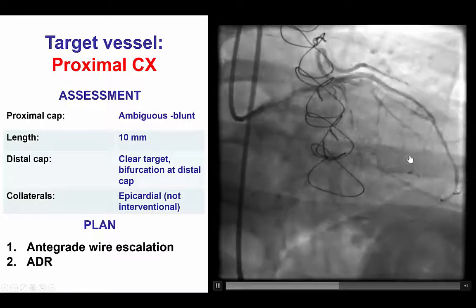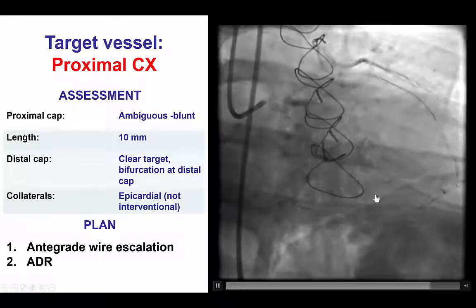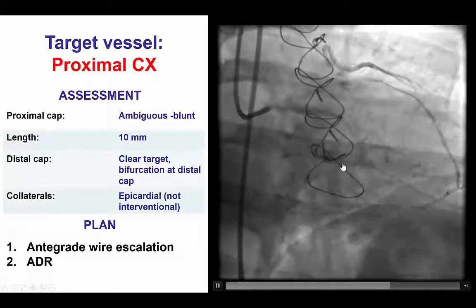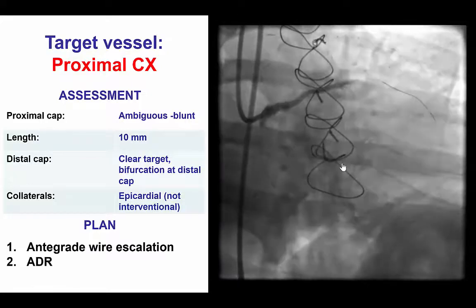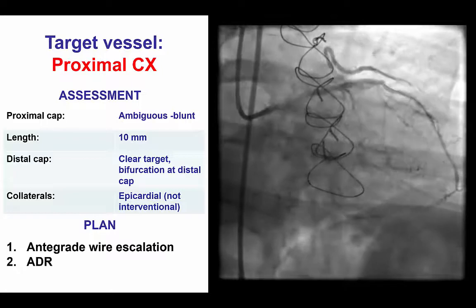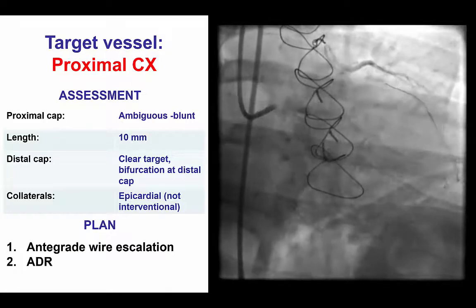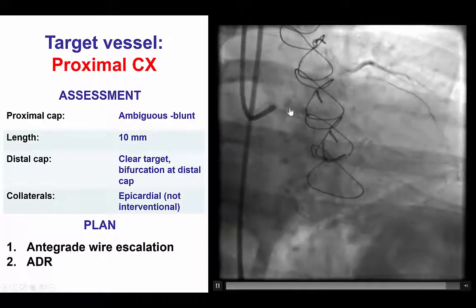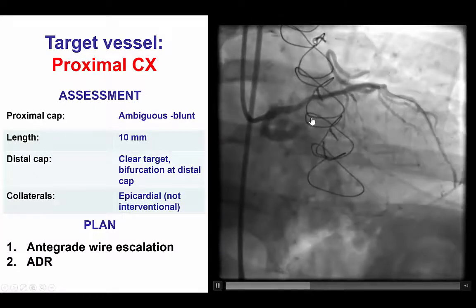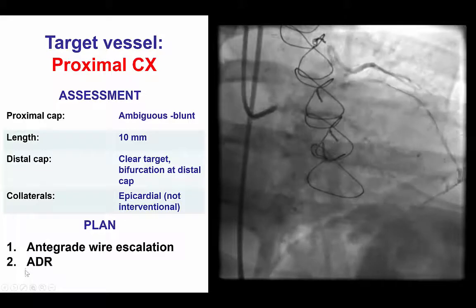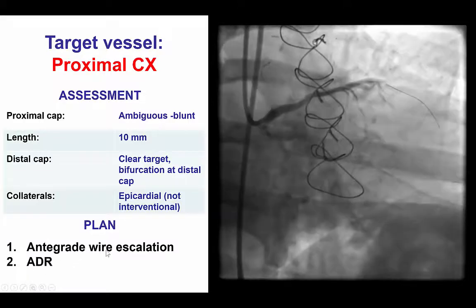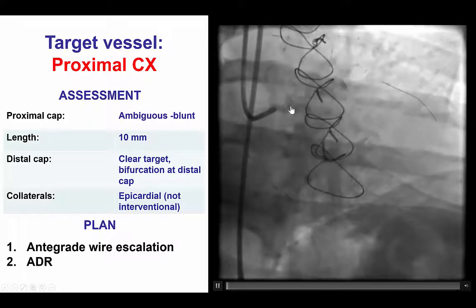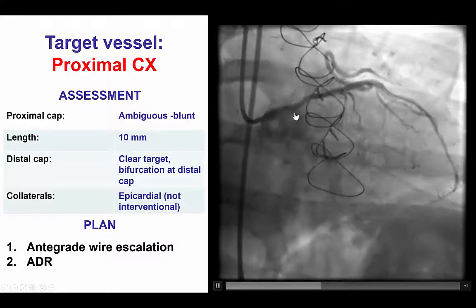The filling of the OM and the circumflex was through epicardial collaterals that did not appear to be suitable for the retrograde approach, therefore they were non-interventional. The plan was to try antegrade wire escalation, given that it's a short occlusion and we can see clearly what the distal vessel is, followed by antegrade dissection reentry if the initial approach failed. That would have been a little more challenging because there appeared to be a previously placed stent into the ostial circumflex.